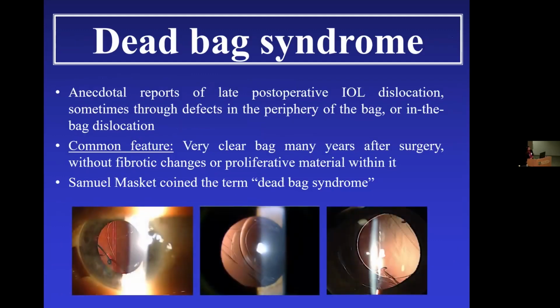And you probably heard about dead bag syndrome. These are very interesting cases where the common feature is that the capsular bag is very clear many years after surgery, without fibrotic changes or proliferative material within it. And Dr. Maskett coined the term dead bag syndrome. You can see some of the photos here.